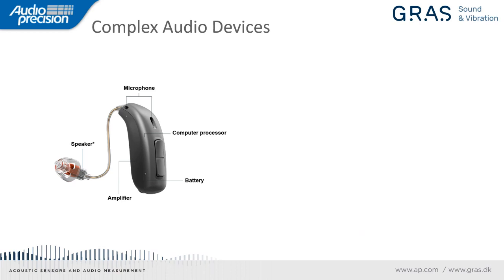This is a rather large behind-the-ear hearing aid that fits behind the outer ear. But as we'll see, there are some tiny ones that are completely hidden inside the ear canal. Now, in addition to these basic features, hearing aids can have a lot of additional features, such as noise reduction.